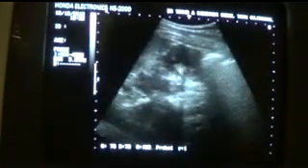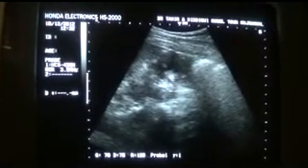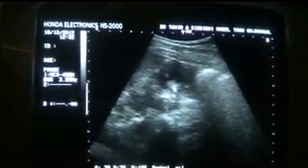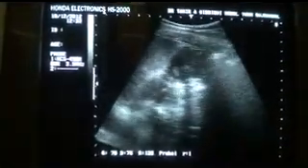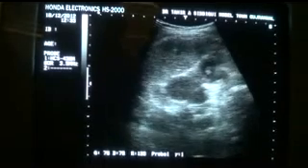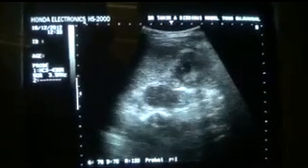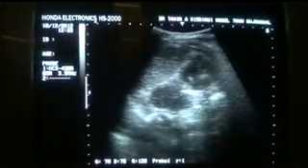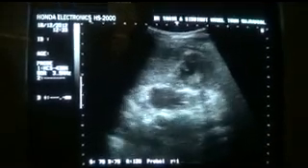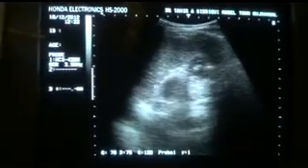This is the mid region. Now this cystic area with internal echoes that we were seeing initially has a calcification in it that gives posterior shadowing in the mid region of the left kidney. Now when I come across to the upper pole, I do see a well-demarcated echo-filled area moving with the kidney, sharing the capsule of the kidney.